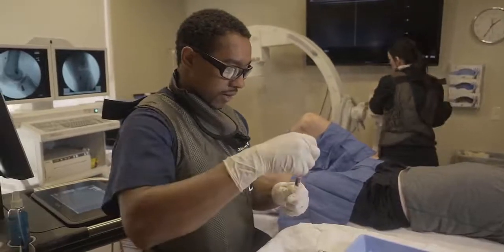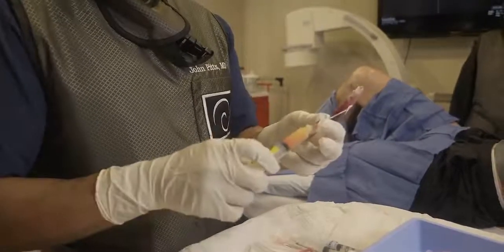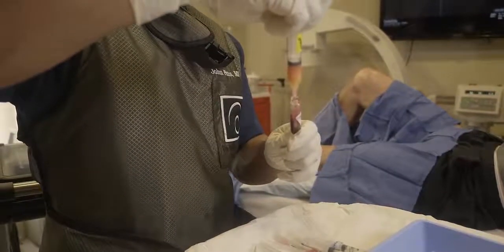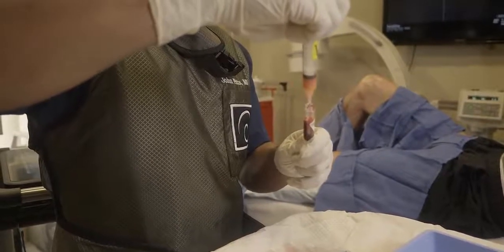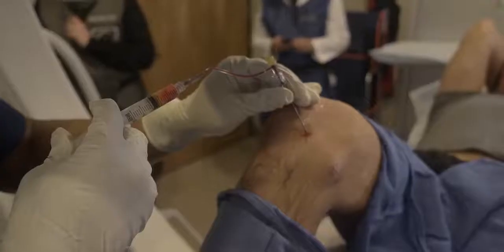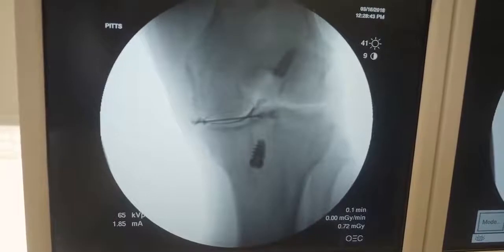I have our bone marrow concentrate, I have platelets that we made from the bone marrow, and I have adipose tissue graft. It may have a few stem cells in it, but it does have other factors that can contribute to repair and provide some structural support as well. We now have a nice filling of the entire meniscus — medial to lateral.